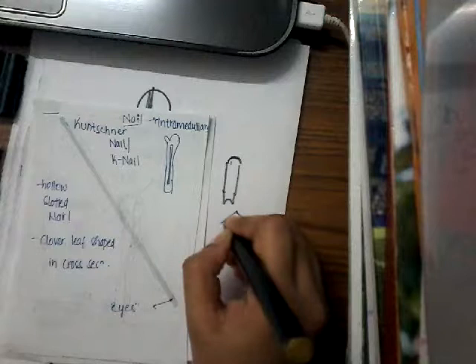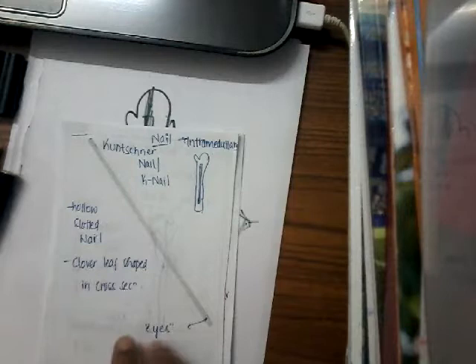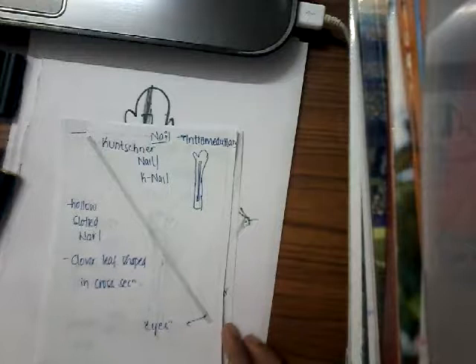It has two holes, one on either side. These two holes are called the eyes of the nail.